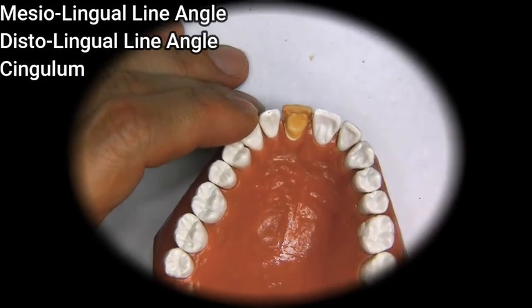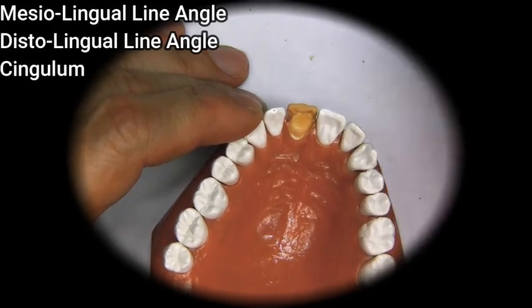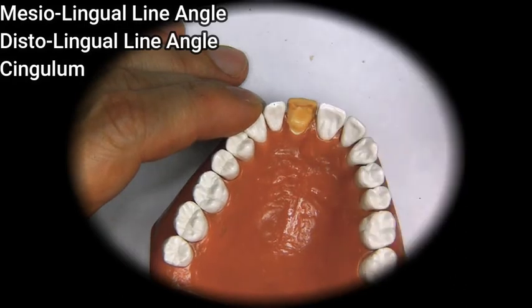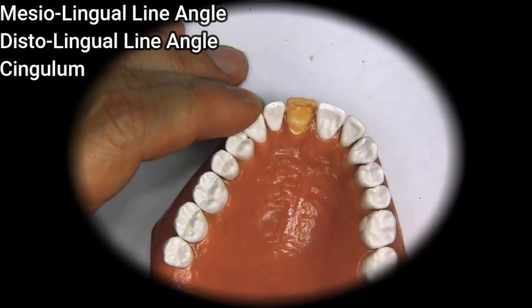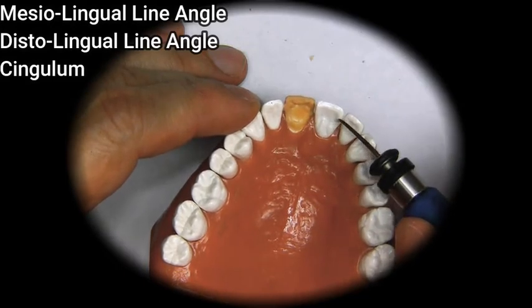So we're going to move on, and we're going to create the distal line angle, the distal marginal ridge. It's called the distal marginal ridge. It's the distal margin of the tooth, or the distal end of the tooth. It's right here, right at the end here.